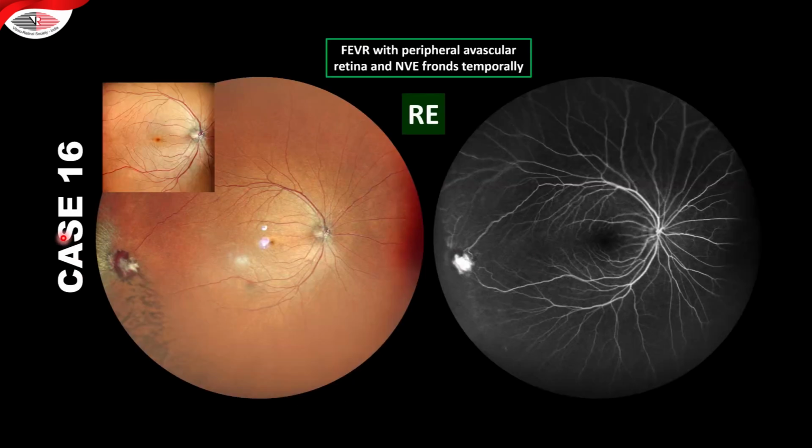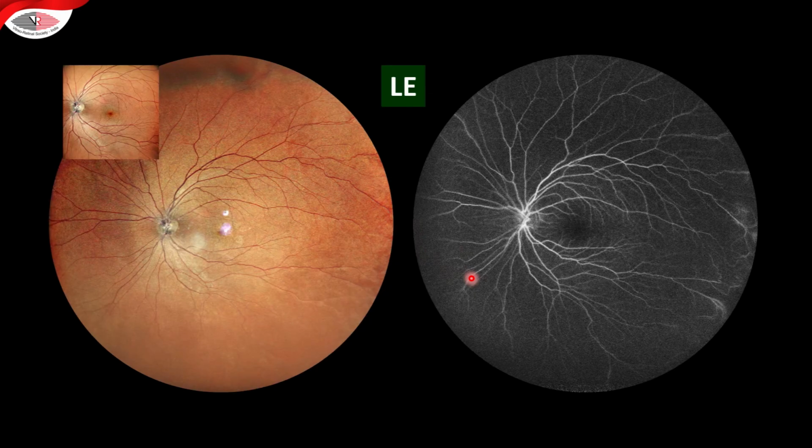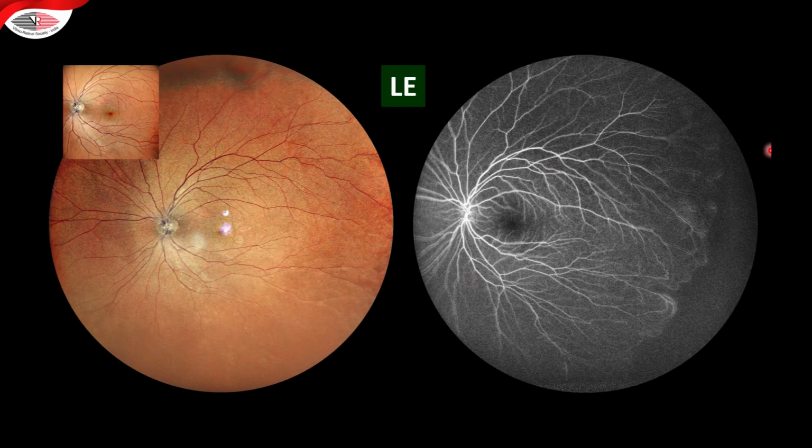This is a patient of FEVR. You can see a front of neovascularization in the periphery, which is seen very well on the angiogram that's been done here. And you also look for other areas which might be there, which require more treatment. So the wide field angiography helps a lot for these kinds of cases. This is the other eye of the patient, which we are seeing. And if you look at the extreme wide field, you'll see these are the skip areas in the periphery. I mean, the ischemic areas which can, in the long run, form neovascularization and cause further problems.